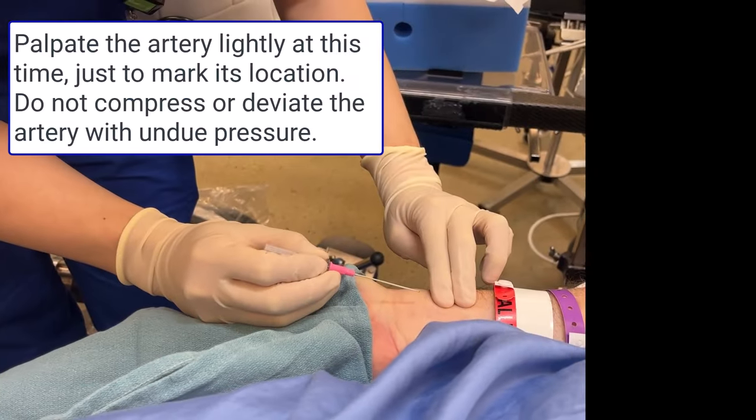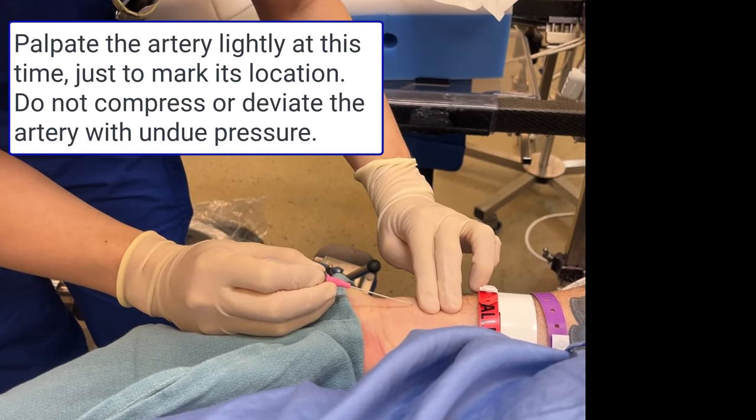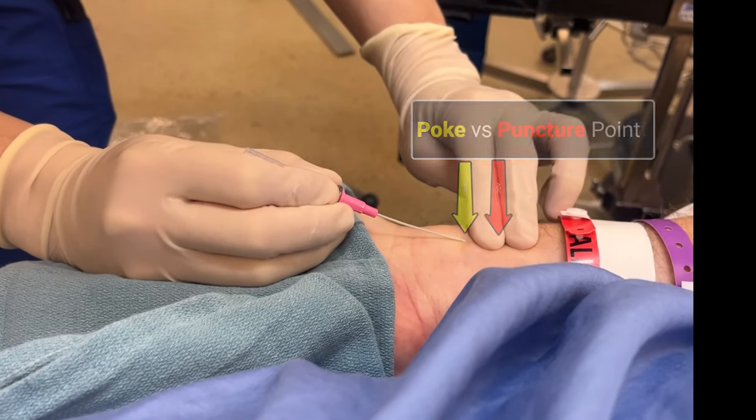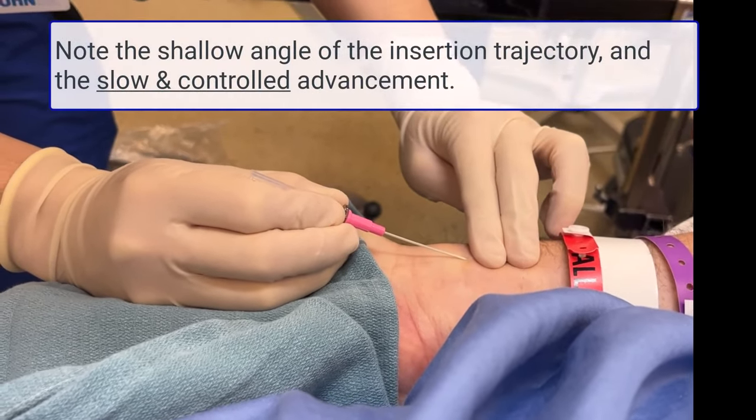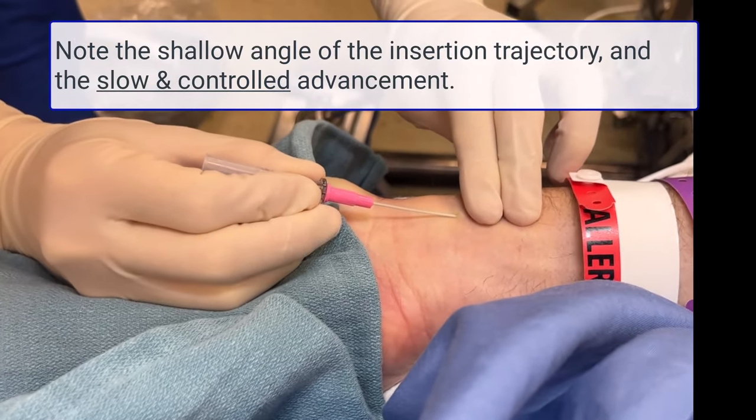You should only be lightly palpating the artery, not compressing it or pushing it to one side. Advance in a slow, controlled manner at a shallow angle. Drive forward in a straight line without trying to steer the needle tip left or right as you advance.